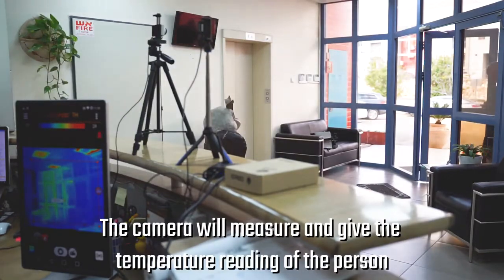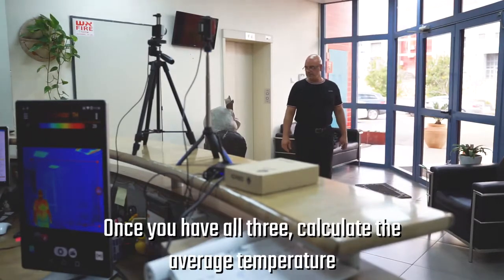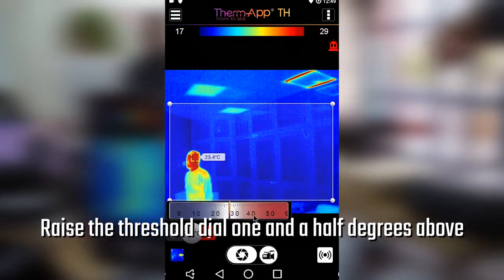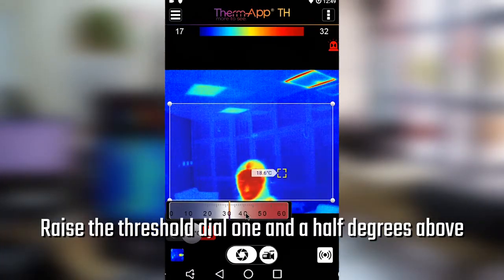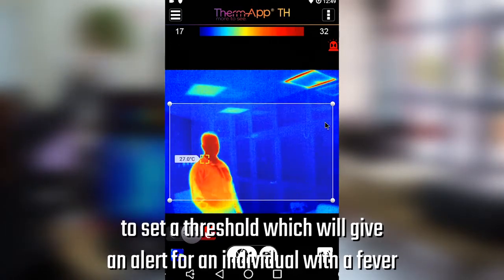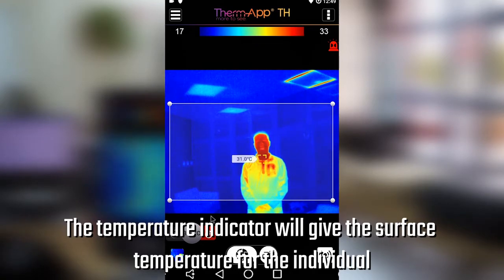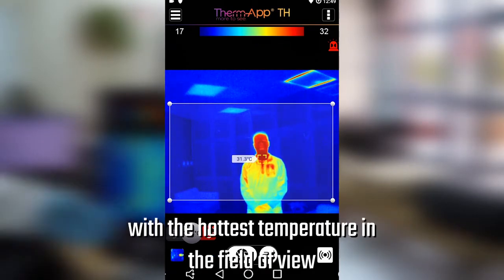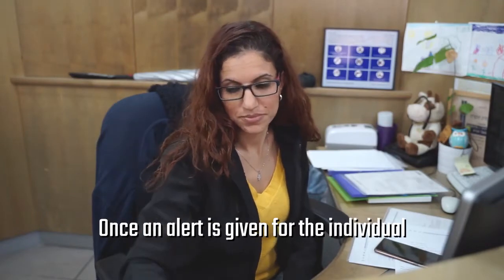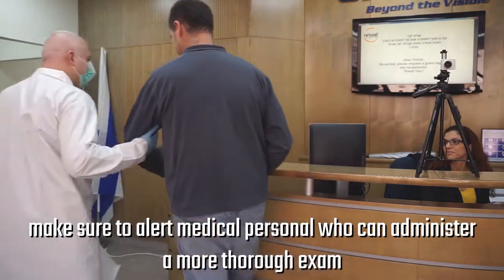The camera will measure and give the temperature reading of the person. Once you have all 3, calculate the average temperature. Raise the threshold dial 1.5 degrees above to set a threshold which will give an alert for an individual with a fever. The temperature indicator will give the surface temperature for the individual with the hottest temperature in the field of view. Once an alert is given for the individual, make sure to alert medical personnel who can administer a more thorough exam.